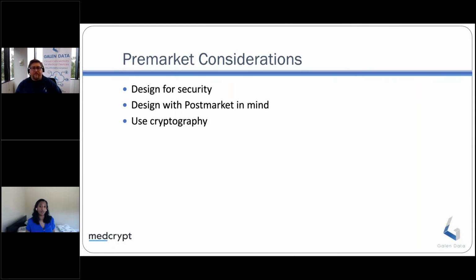And this isn't even accounting for this kind of meta trend we're seeing in healthcare where devices are going home with patients, especially in the pandemic. The notion of delivering care remotely or having someone be remote hugely took off. And I don't think that's going to diminish over time, where we're in a position where people like getting care from home. They don't want to go in if they don't need to. So how do you tell someone with a glucose monitor in their house that they have to flash the firmware on it? It doesn't seem like a reasonable ask, right? We really have to consider how this thing is going to be used in the hands of the patient in terms of how we design security for them.